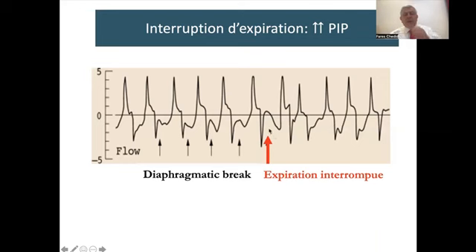However, when it goes above the line of 0, we don't call it diaphragmatic break anymore. We call it expiration that's been interrupted. Sorry, it's written here in French because I just finished a talk with Tunisia. I was speaking in French with them.